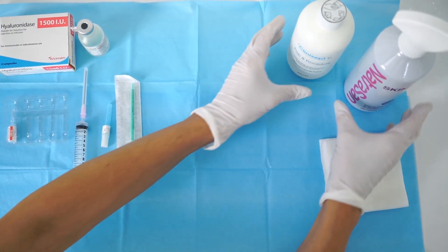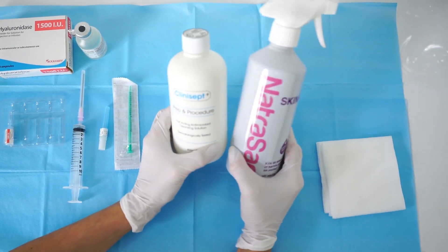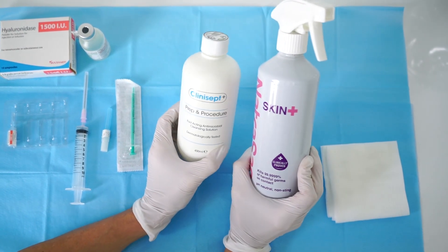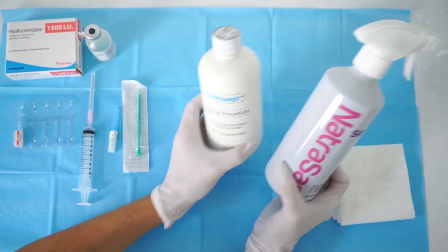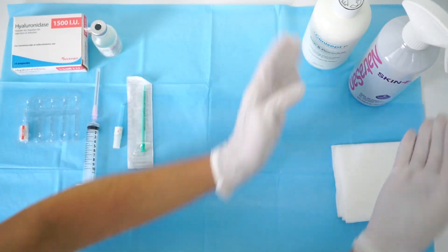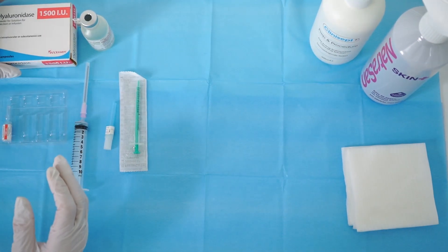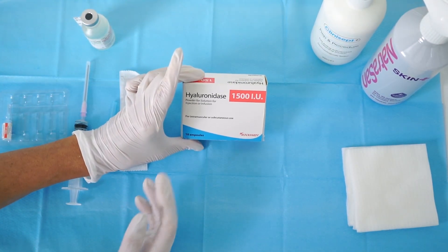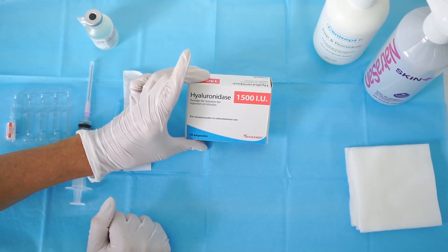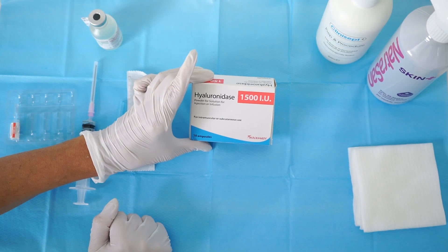Let's have a look. You are going to require a cleansing product, either maybe Natrasan skin or Clinicept. Either of them are very good to clean the skin with your gauzes. Then, this is our Hyaluronidase 1500 units, you can purchase that from the pharmacy on prescription.